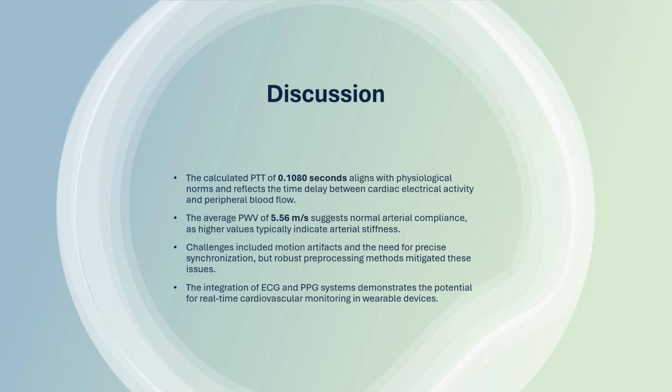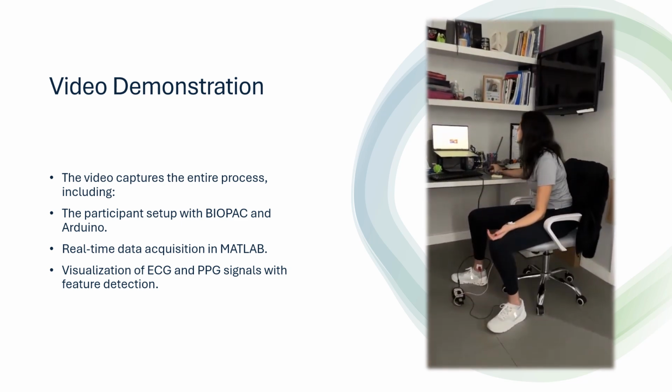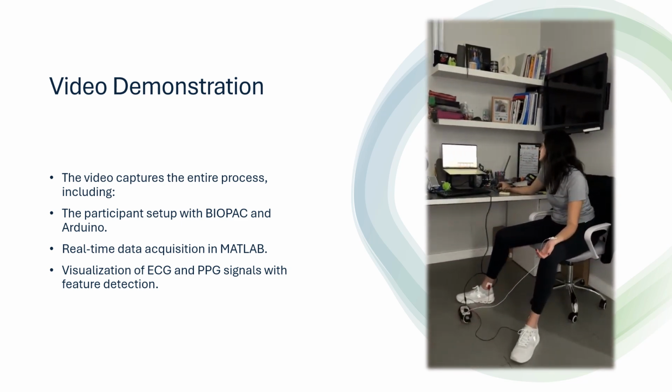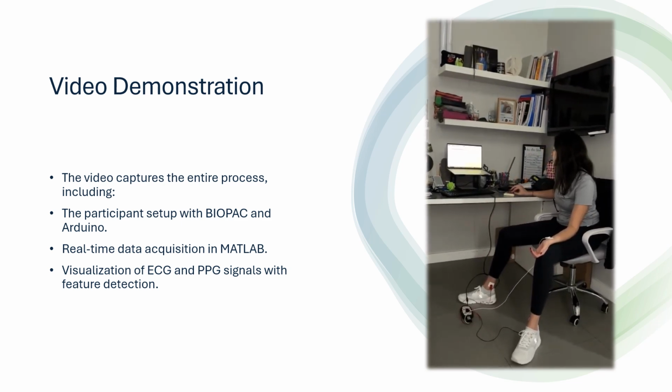Overall, this experiment demonstrates the potential for non-invasive cardiovascular monitoring with applications in wearable health devices for real-time assessment of blood pressure and arterial stiffness. Now we will show a brief video demonstrating our experiment. This video captures the entire process, including the participant setup, signal acquisition using BIOPAC and Arduino, and real-time data visualization in MATLAB.